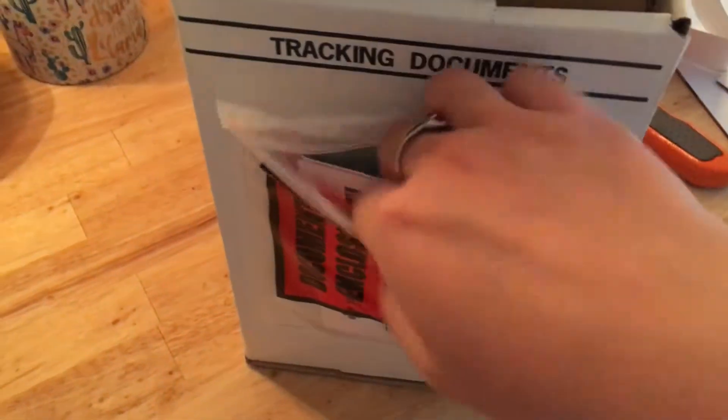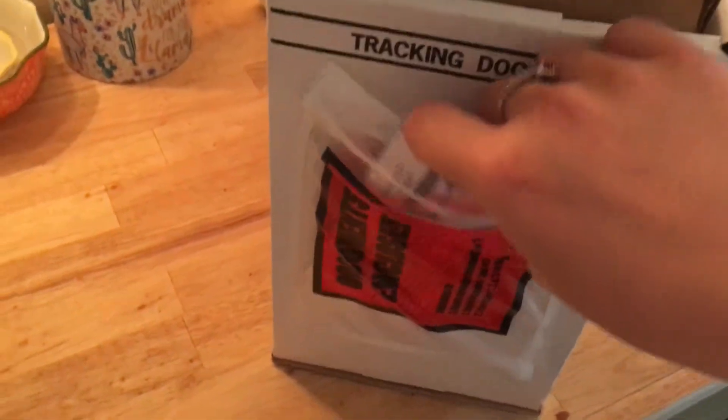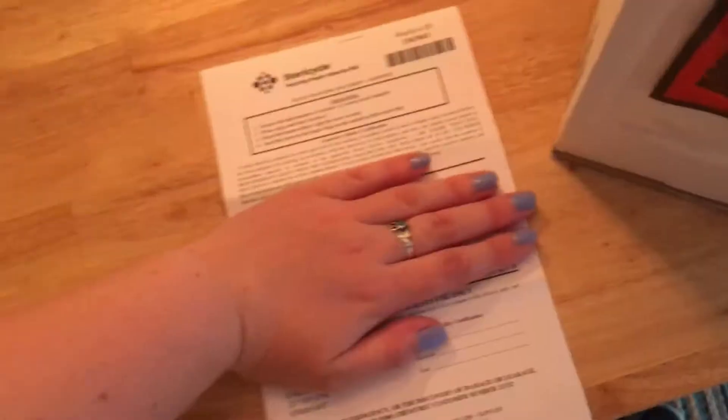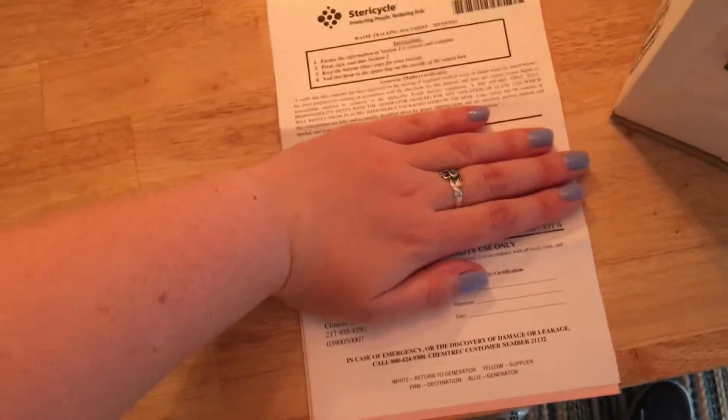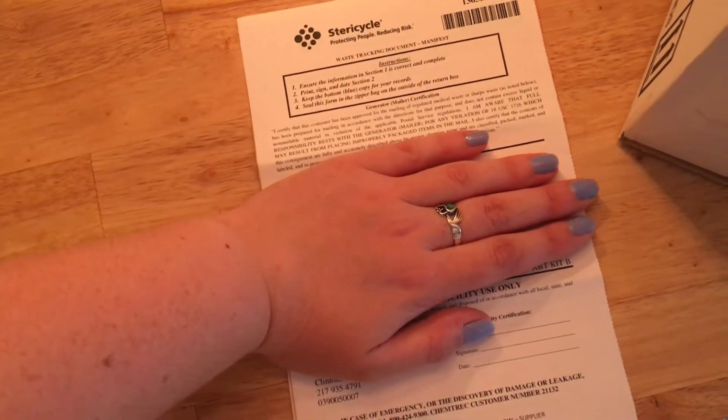That is as tight as I'm going to get it, and I'm going to stick it back in the box. Before I seal the actual box, I'm just gonna make sure the invoice hasn't changed. This pamphlet is A-plus packaging because they have a picture guide — it literally walks you through step by step what you need to do. I have my hand over my personal information, but it already pre-prints your address and everything.